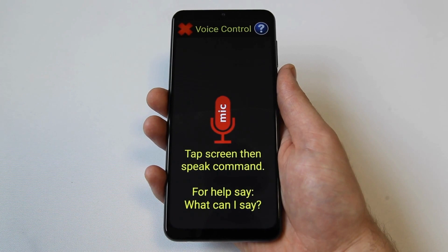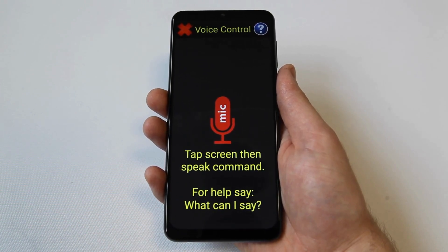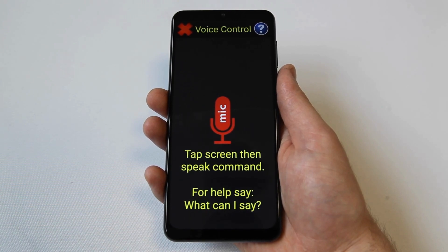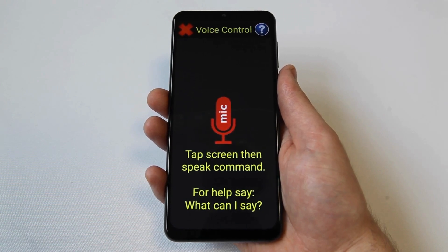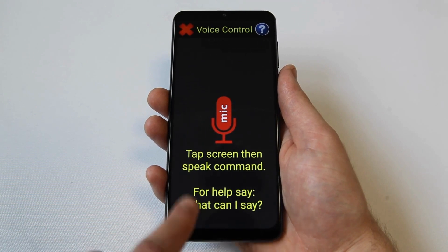Once in the voice control menu, tap the screen and wait for the beep. Then speak a command and the voice control will activate. There are many different commands you can use. If you need help, just press the screen, wait for the beep and say, what can I say? This will display a list of available commands.